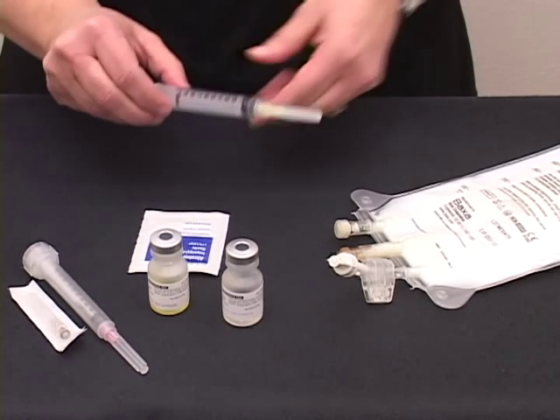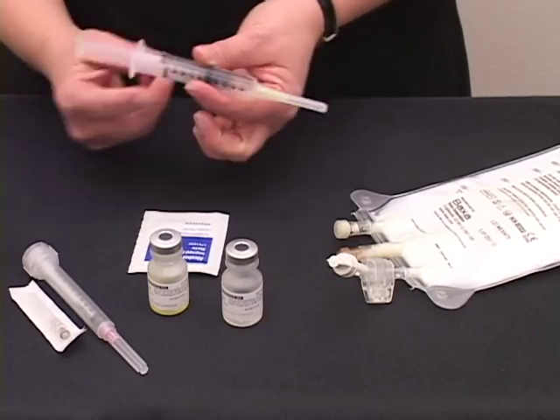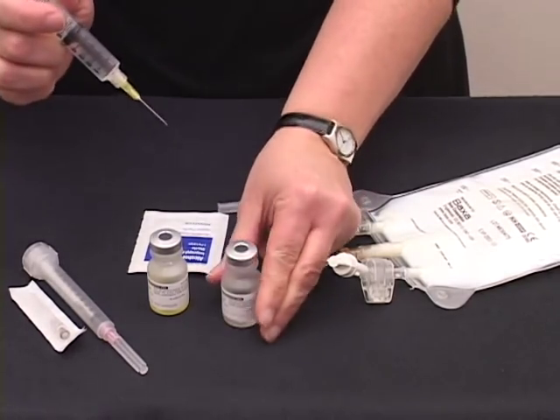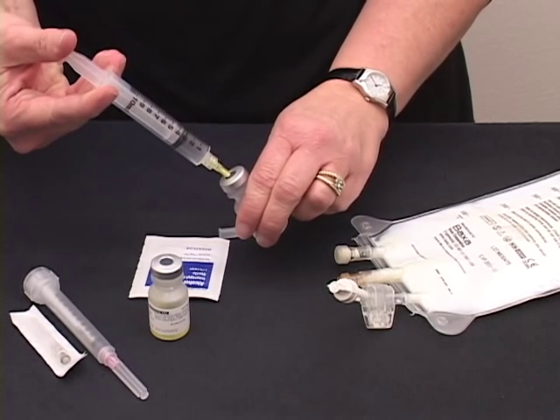Pick up your syringe and pull the plunger back to the ordered amount. Remove the cap from your needle, stick it into your rubber stopper, and inject the air into your vial.